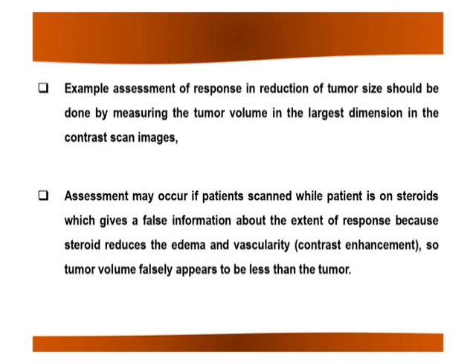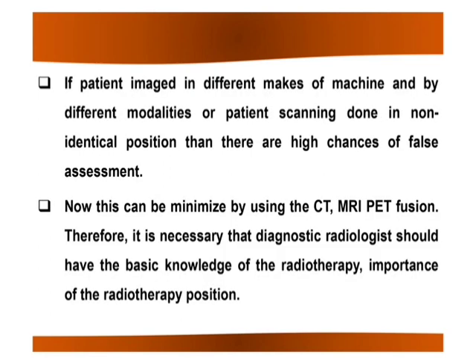Improvements in image fusion and portal imaging related to organ movement during treatment and evaluation of response are being tackled in a better way nowadays. The organ movements and dose delivery to biologically resistant tumors will be another area of research. In future, time adaptive radiotherapy and biological adaptive radiotherapy will be the major areas of research.